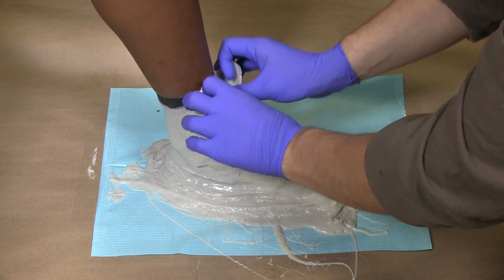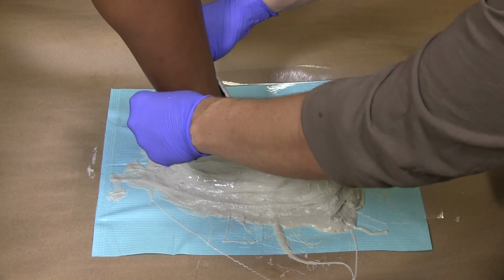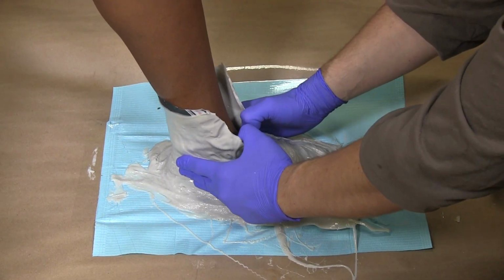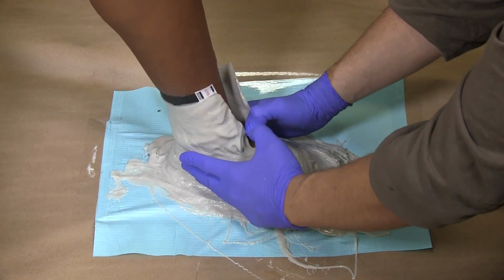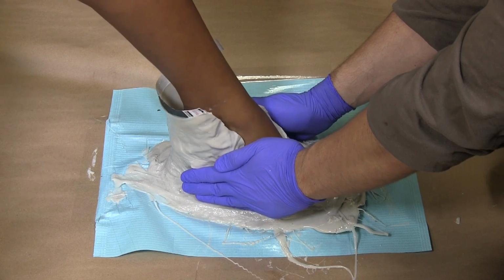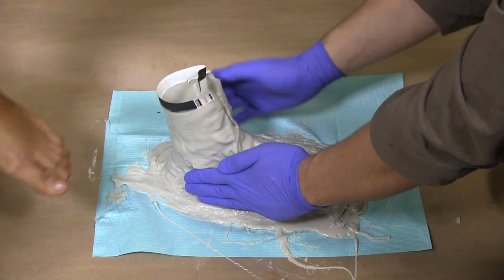Instruct the customer to wriggle his or her toes to break the seal of the mold. Remove the impression at a slow pace to avoid ripping out surface hairs around the ankle. When the customer feels ready and that the impression is loosened around the toes, firmly grab the impression and instruct the customer to slowly remove his or her foot.